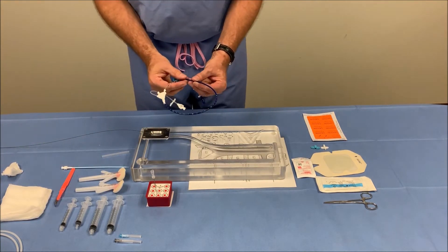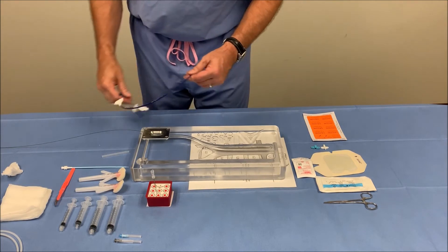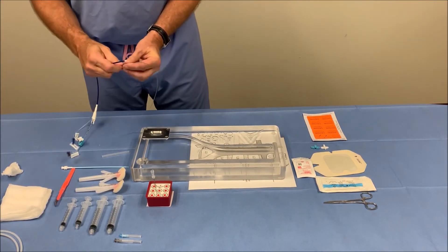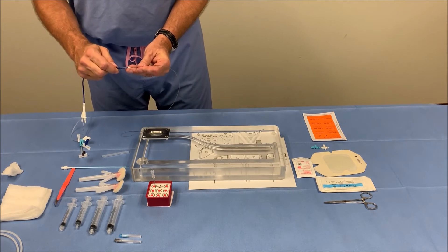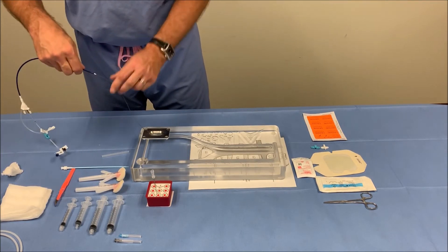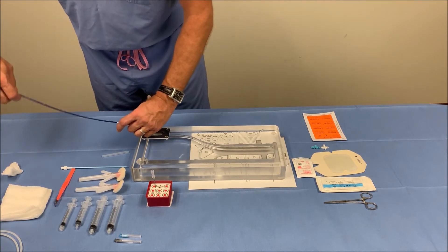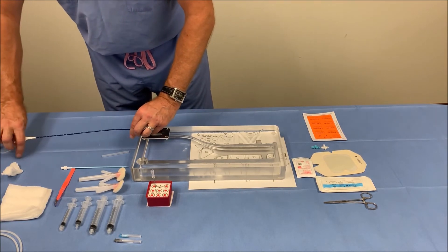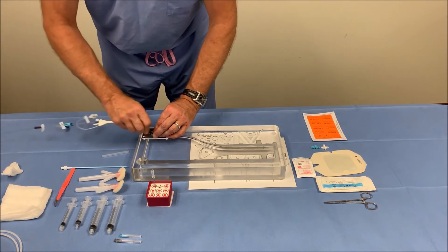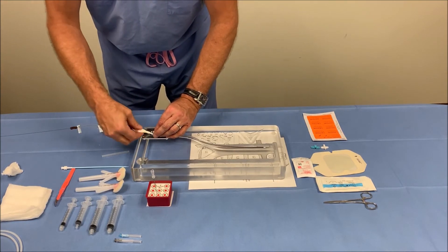Prior to inserting the catheter, you want to make sure that the pad printing is up. We'll go ahead and insert the Angel catheter all the way to the hub.